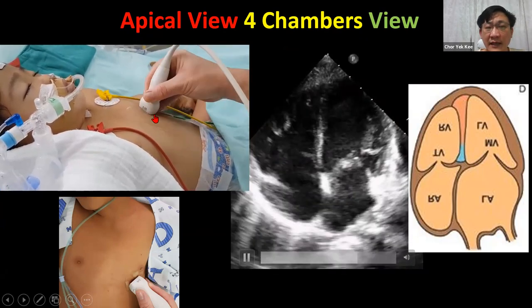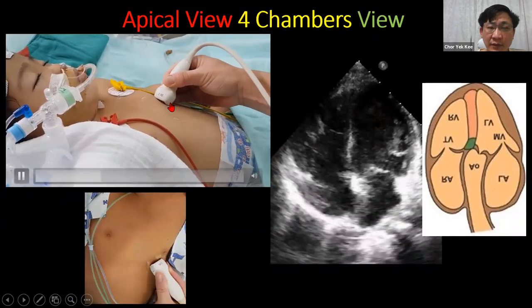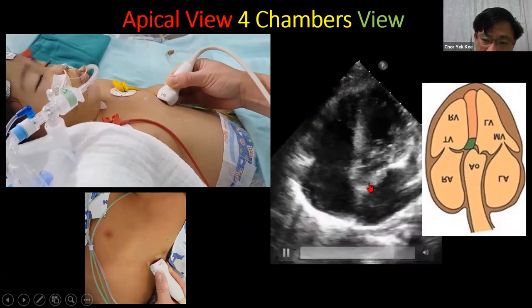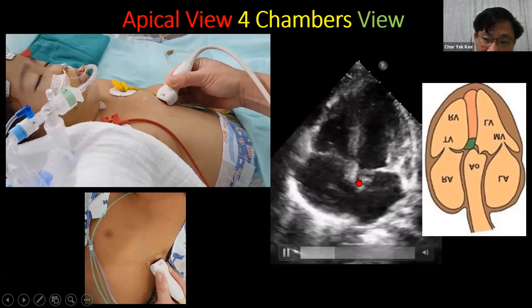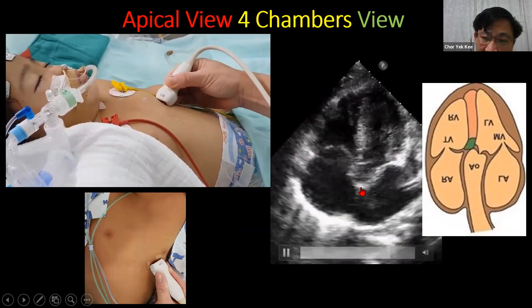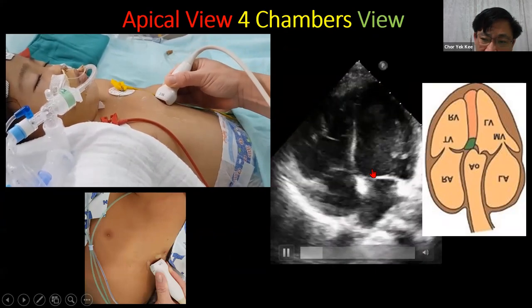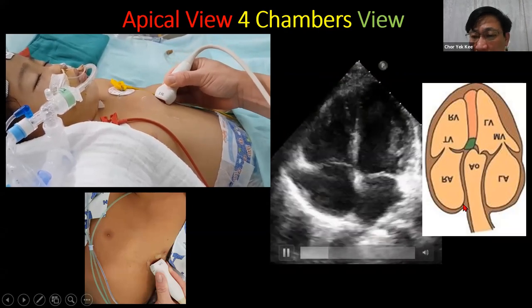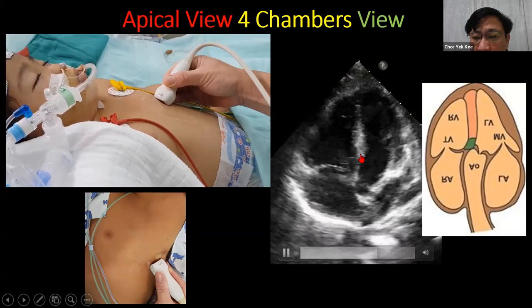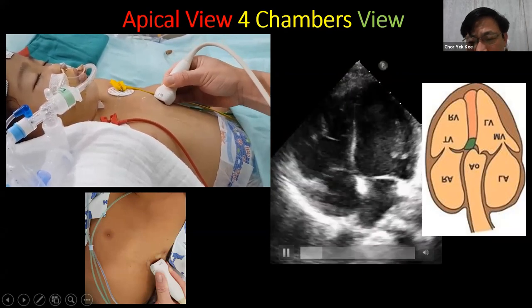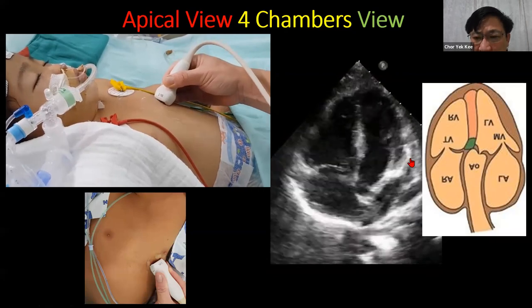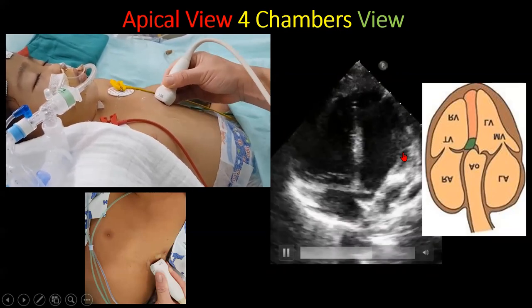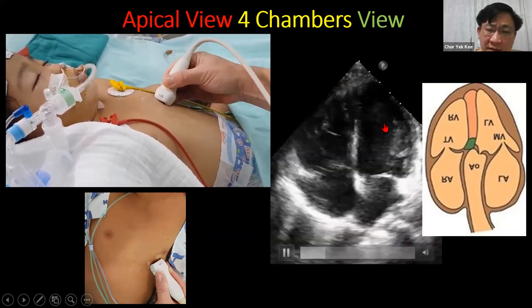From the four-chamber view, tilt the probe slightly upward and another chamber appears — this is the fifth chamber, which is the aortic root and the aorta. This five-chamber view is important for more advanced cardiac monitoring, where you can measure cardiac output from this chamber.